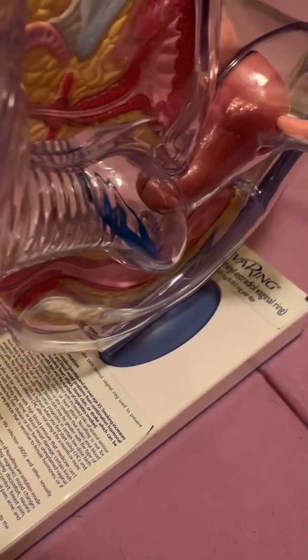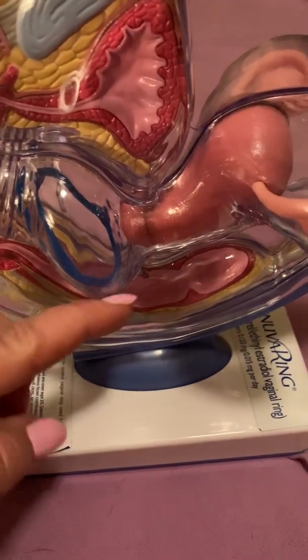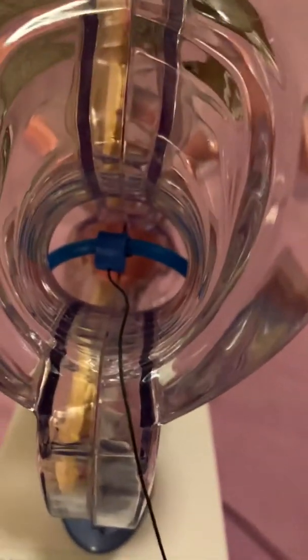Now, this is not a sperm block or anything like that. It just sits at the very base, near the cervix. But this is not like a sponge or a diaphragm, which prevents sperm from entering the cervix. This is a hormonally dispensed ring. And I'm going to go over some side effects of this hormonally based ring.